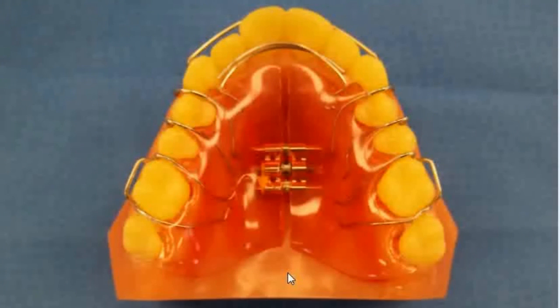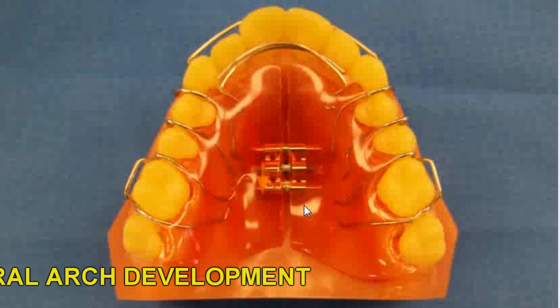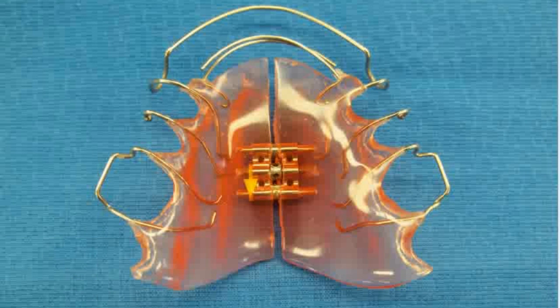The most popular removable appliance to expand the upper arch is this appliance, the Schwartz appliance. This appliance works by turning the expansion screw in the center of the palate. Turning the screw puts pressure on the palatal tissue and the teeth in a lateral direction. This appliance works in the mixed or permanent dentition and can be used for patients of all ages, including adults.